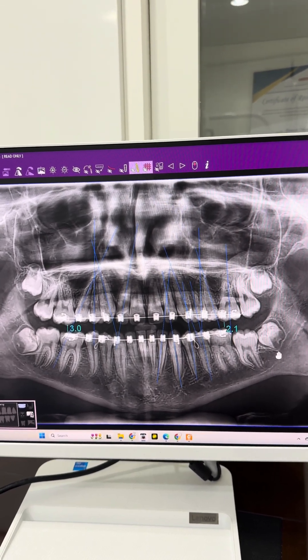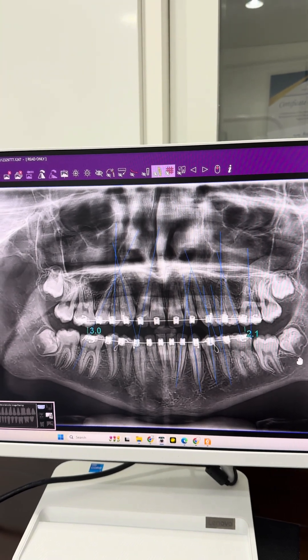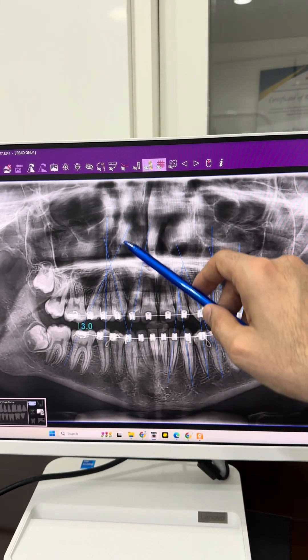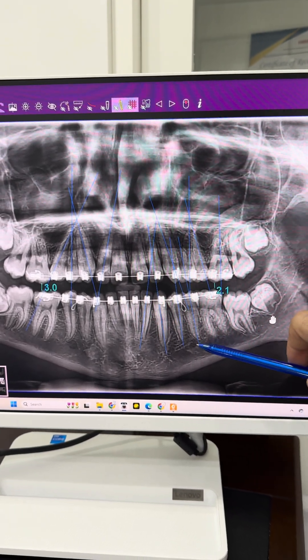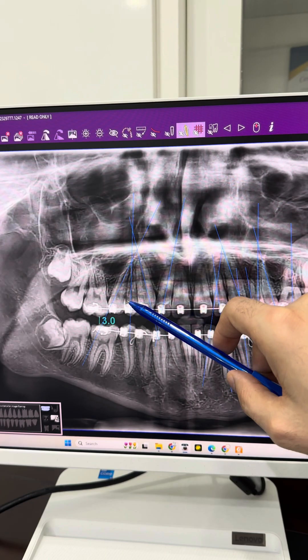We did the x-ray and the mother was surprised about the mistakes we found. We can see the wrong tipping — almost all the roots are in contact, while the roots should be parallel. This is very important.